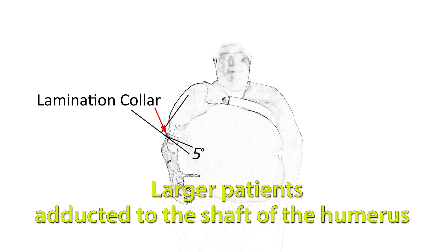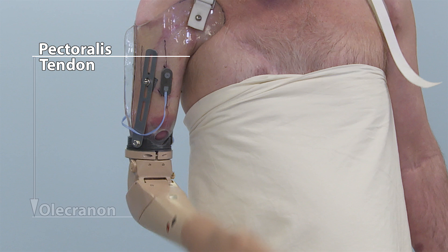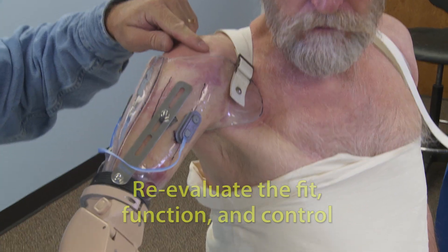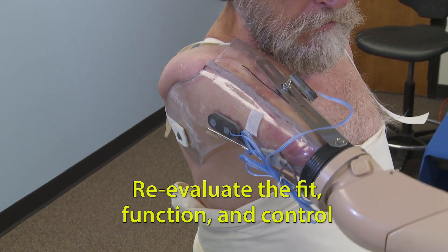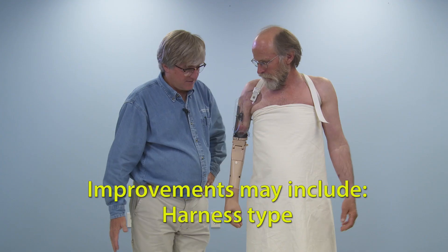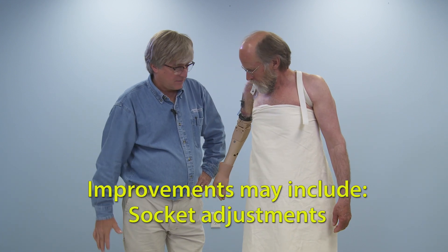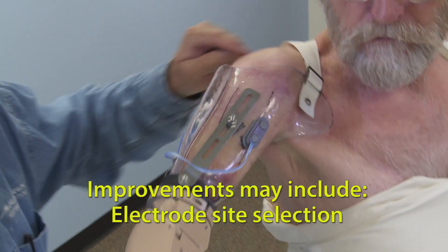This keeps the axis of the elbow operating within the work envelope. Using the measurement from the pectoralis tendon to the olecranon, minus 4 inches, position the lamination collar directly under the socket. After installing the electrodes and attaching the prosthesis, re-evaluate the fit, function, and control of the prosthesis and make any necessary improvements. These may include harness attachment points, harness type, changing AP or ML dimensions, socket adjustments to ensure electrode contact throughout range of motion, electrode site selection, and most importantly, patient comfort.